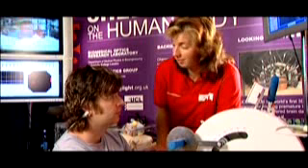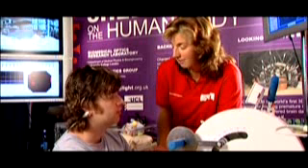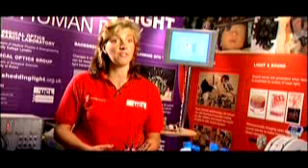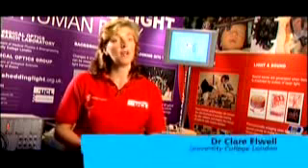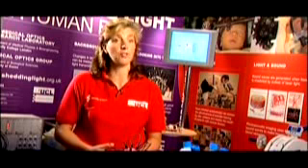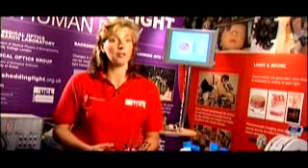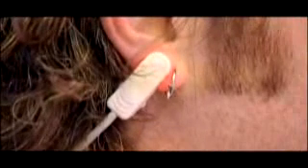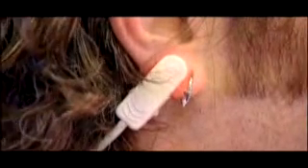We're going to use light to look at the colour of your blood as you're exercising. Many people are familiar with the idea of using visible light to look at processes within the body. For example, arterial blood appears bright red because it contains lots of oxygen. Venous blood appears blue because most of the oxygen has been taken from it. So we can use visible light systems to look at the colour of blood and work out how much oxygen it contains.